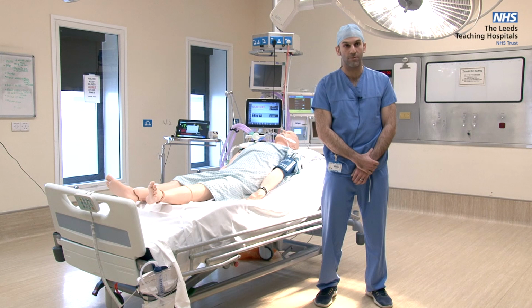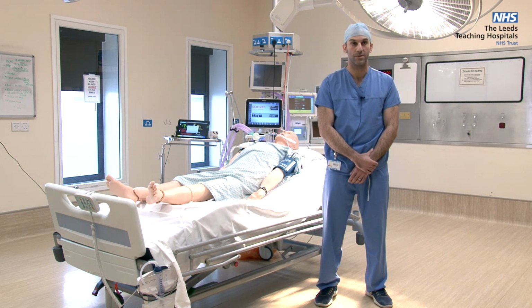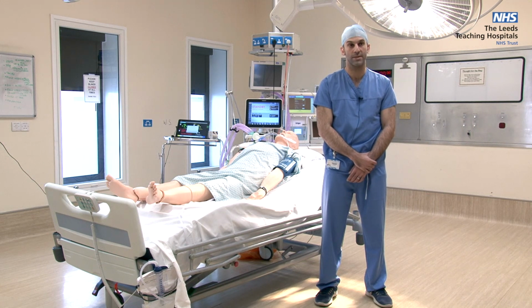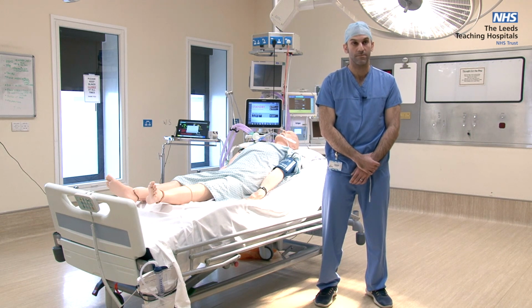The technique that we describe here will be a 4-person technique. There will be 4 assigned roles. There will be the intubator, who is the most senior airway doctor available at that time. They will be the people who perform the intubation. There will be assistant 1, the person who passes the airway equipment to the intubator.